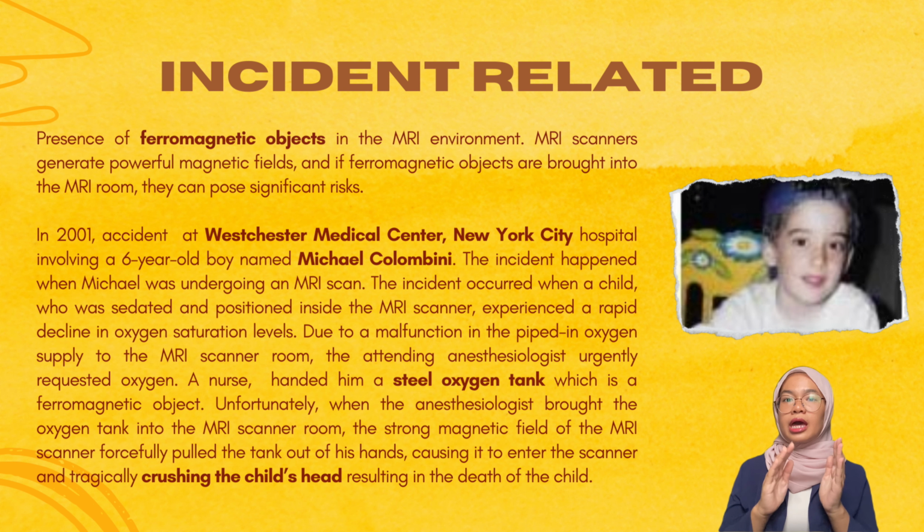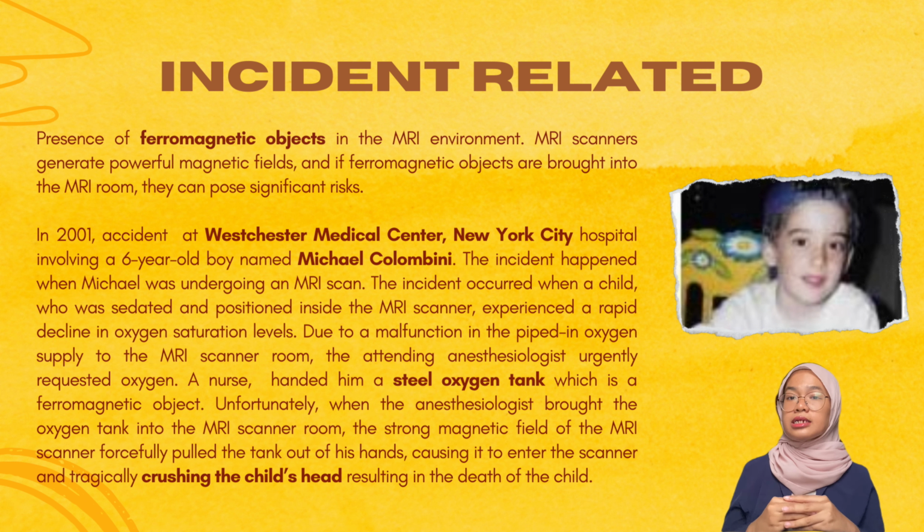Unfortunately, when the anesthesiologist brought the oxygen tank into the MRI scanner room, the strong magnetic field of the MRI scanner forcefully pulled the tank out of his hand, causing it to enter the scanner and tragically crushing the child's head, resulting in the death of the child. Next, I will go deep into the electrical test and safety of MRI machines.